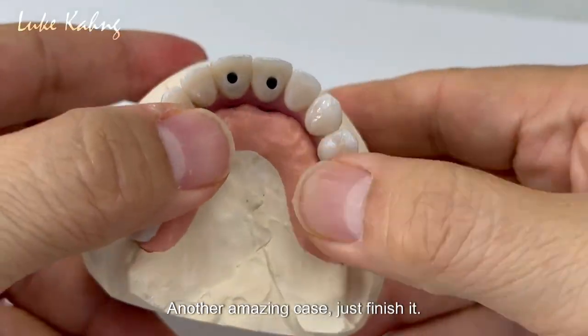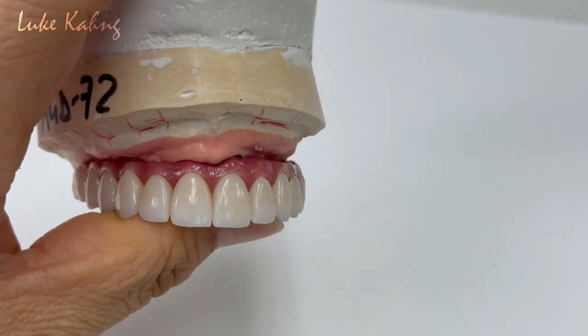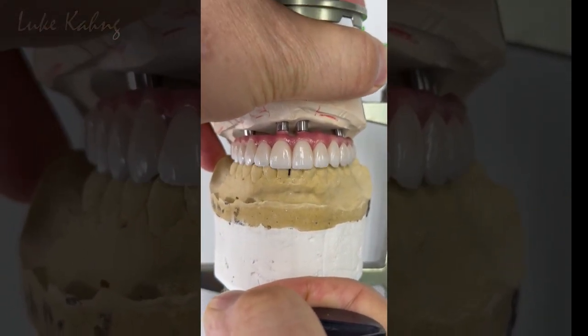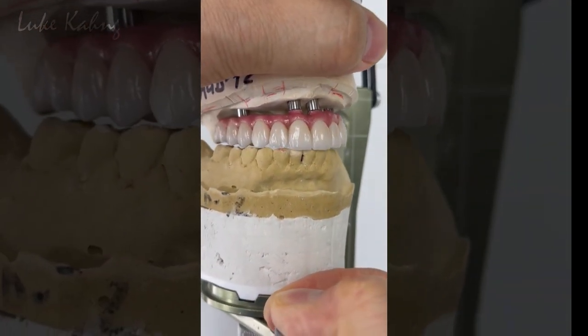Another amazing case just finished. So this is the final cementation.